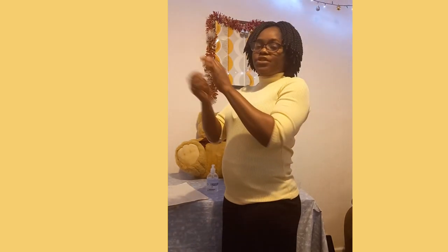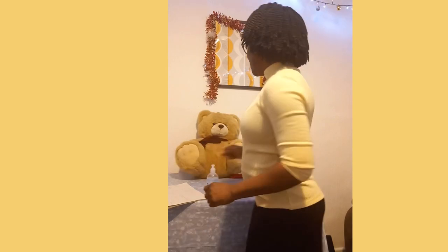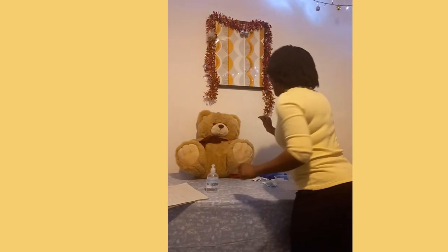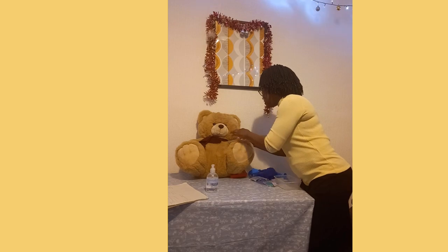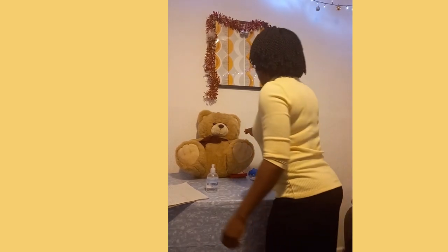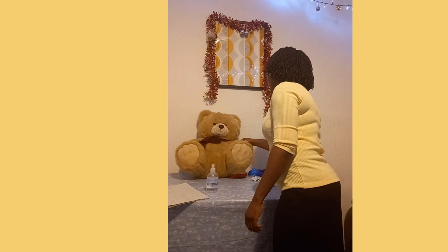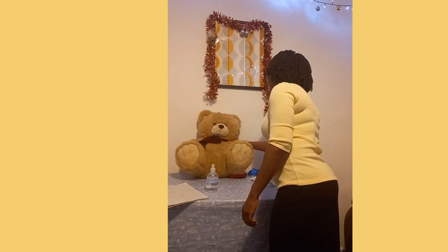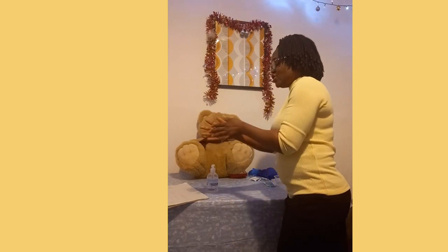I'm going to perform my hand hygiene again, then examine the site I want to use for the administration. Is it okay if I touch your right arm, Malcolm? All right. I can assess the area and I can see that it is not swollen, there's no sign of inflammation, no sign of infection. I am happy to use this site. I perform my hand hygiene again.